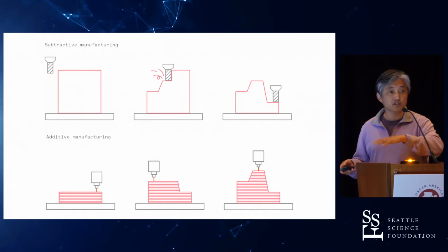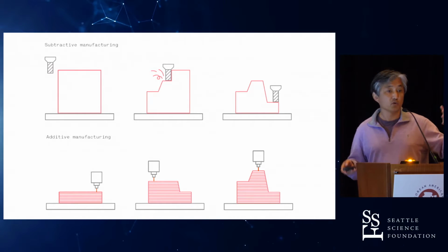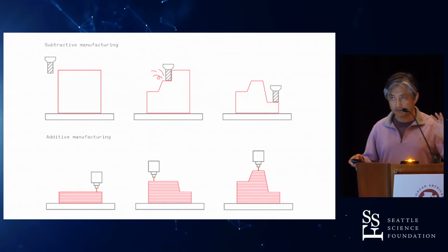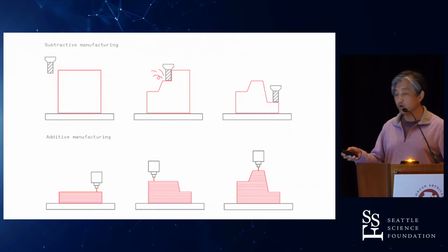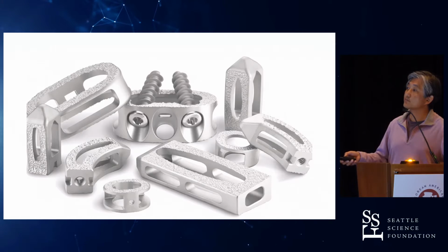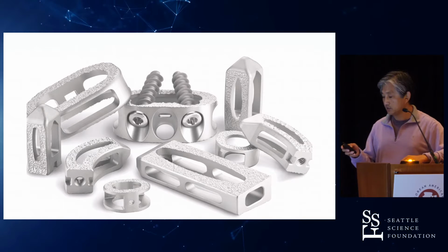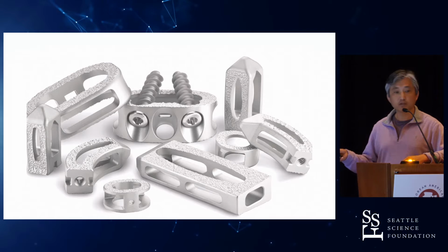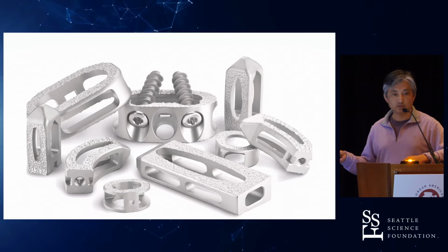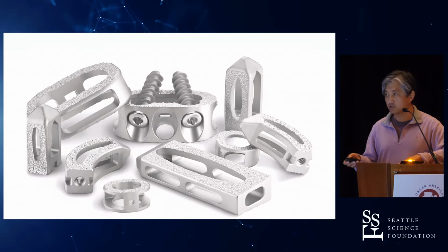So let me present both of these ways that are being done and give you arguments about which is better and what some of the problems of the two different ways are. Again, I've got a slight bent toward Titan Spine because these are all their slides, but there is some argument that one may be somewhat superior to the other. And this is a picture from the catalog that Titan Spine has of their various different kinds of cages. They've certainly made just about everything with the surface-etched titanium implants that, from the data that I will present to you, have some validity to be used in our clinical practices.